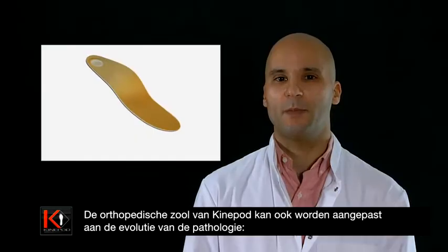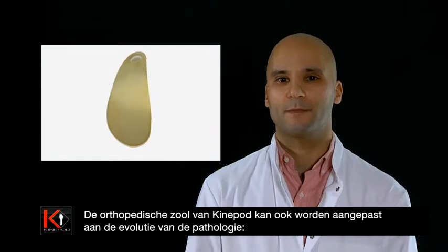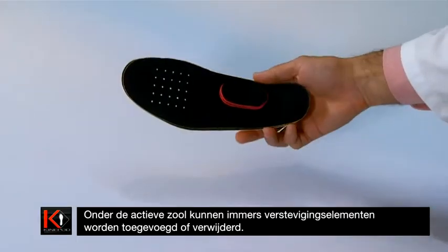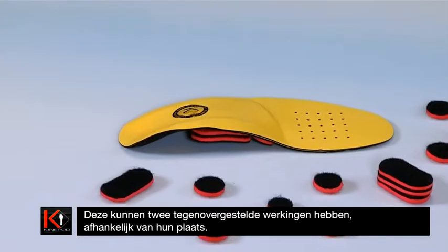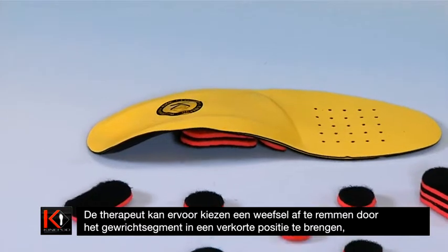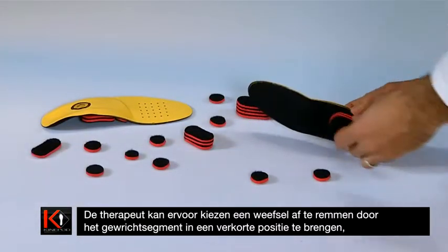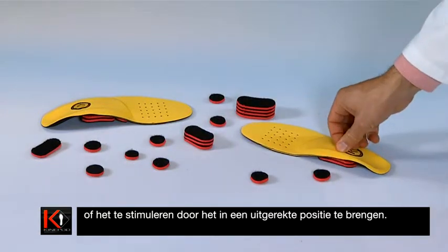The Kinopod orthopedic sole is also adaptable according to the pathologies concerned. For example, beneath the active sole, reinforcing parts can be added. These can have two opposing effects according to their positioning: the therapist can choose to inhibit the muscle by placing the articular segment in a shortened position, or to stimulate it by placing it in a stretched position.